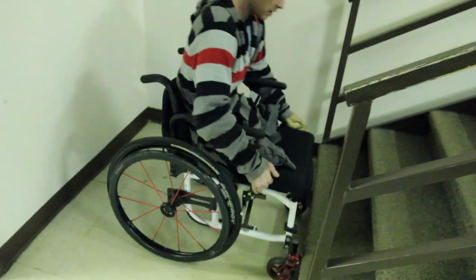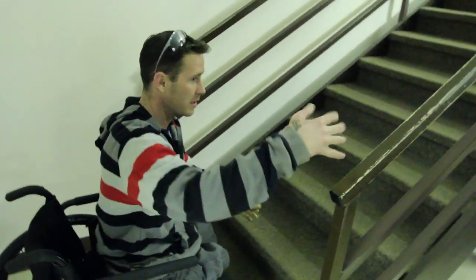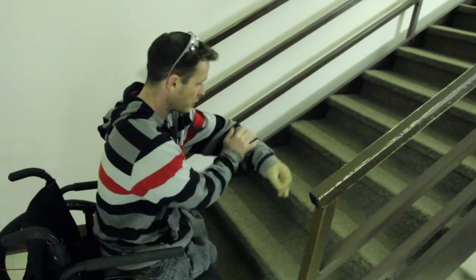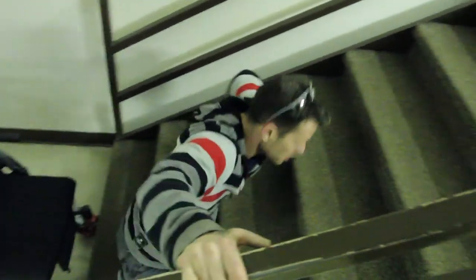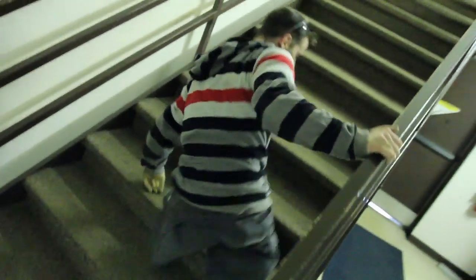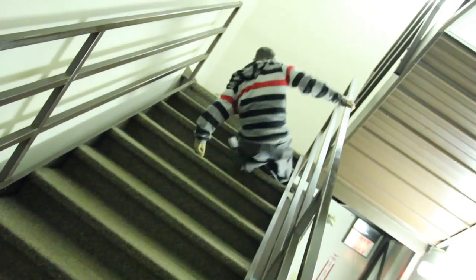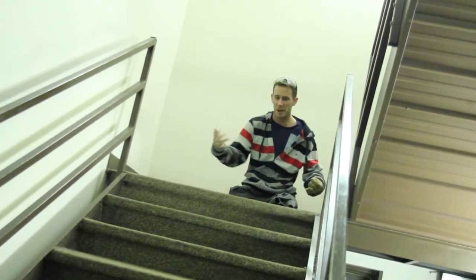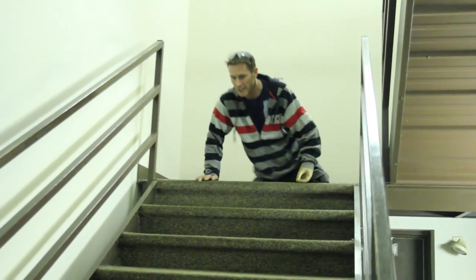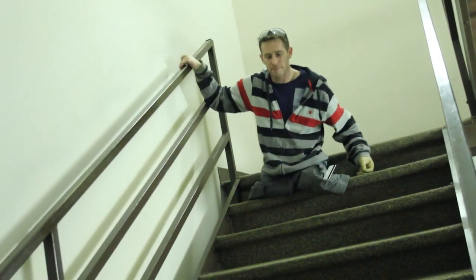Lock up, come up to the front step, lock your brakes. You always use the railing because that's the easiest way for leverage. Put one arm on the step like that, grab the railing, hop off — and that's how you go up. Coming down is very similar: put one hand on the railing, go one step at a time, and just butt it down.